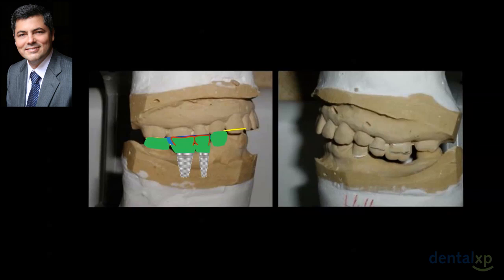So this is an improved occlusal plane, this is an improved curve of Spee, and this is an improved interocclusal setup that will eventually affect this patient in a positive manner. Because this was a patient that actually came to our practice because of headaches, not because of wanting to fill in spaces. This patient didn't come for implants. This patient came for healing of some symptoms related to the head and neck.